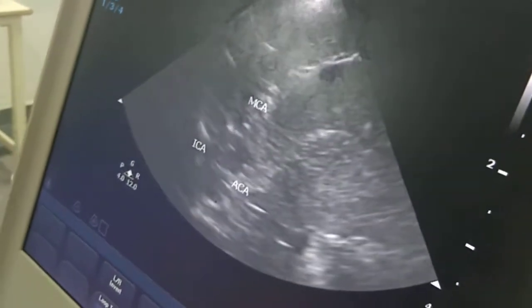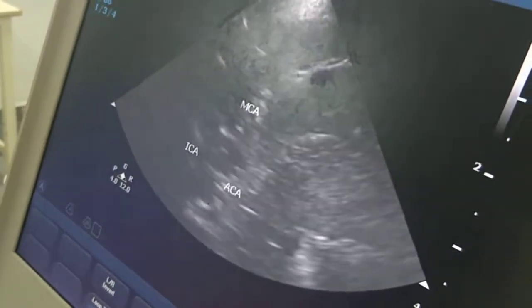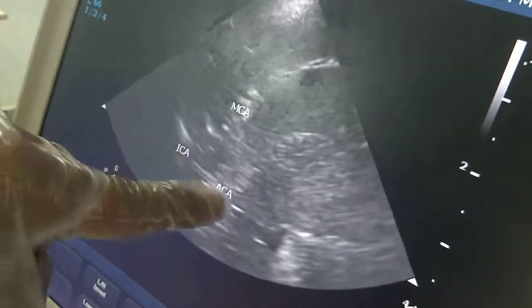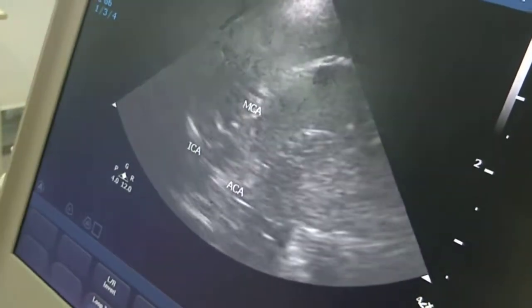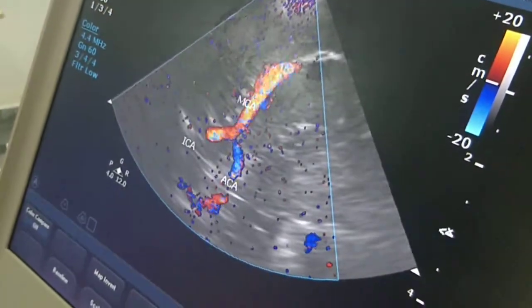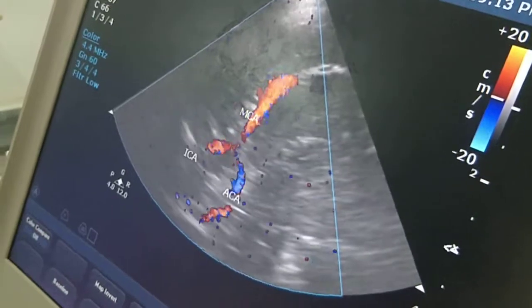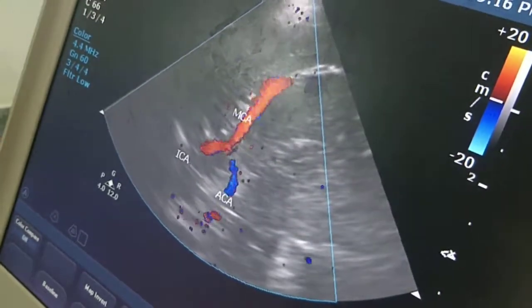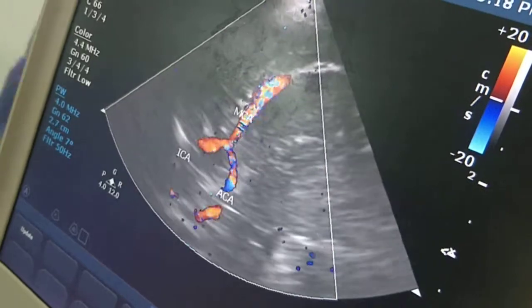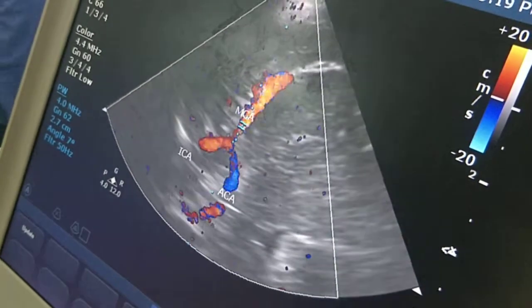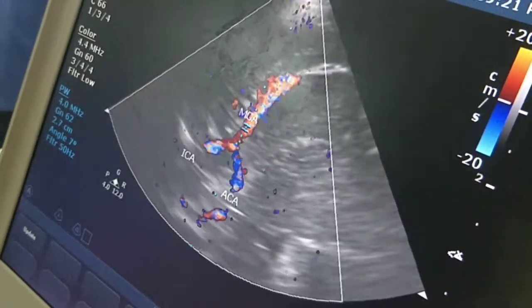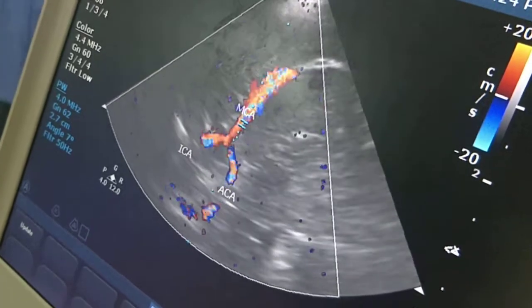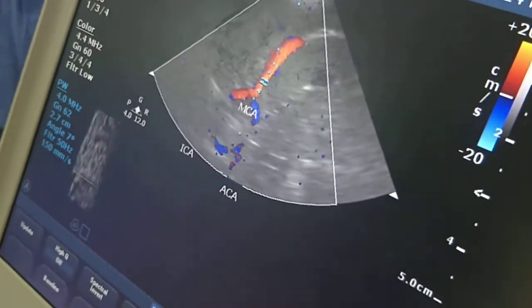You can see the middle cerebral artery — see how beautiful it is. The vessel going up is the middle cerebral artery, and you can also identify the junction between the internal carotid artery, middle cerebral artery, and the anterior cerebral artery, and you can get this image.